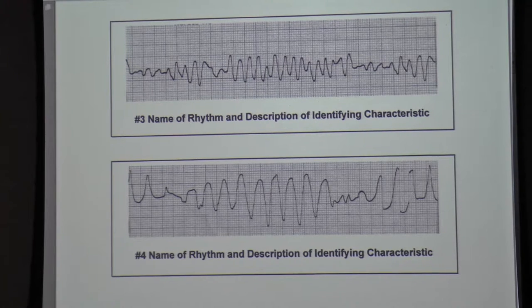So if this was just a patient's unlucky day and they were in a sudden freak electrical disturbance with no heart attack as a precipitating factor or anything like that, they should actually reset and go back into a normal rhythm, especially when you see a coarse one like this.